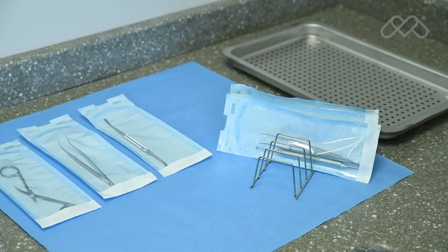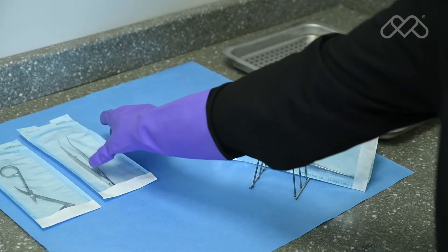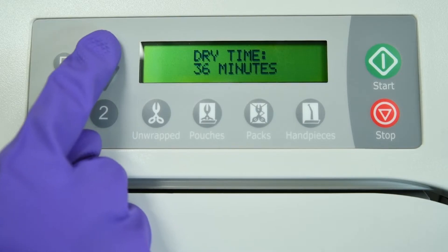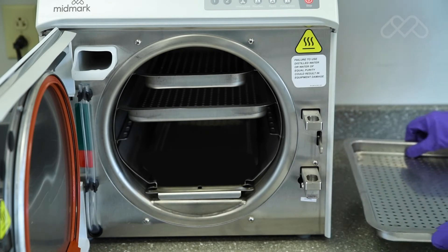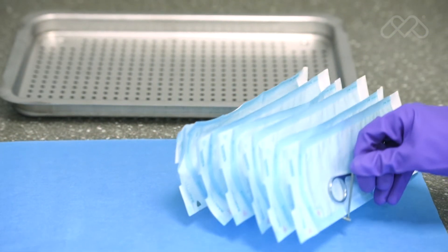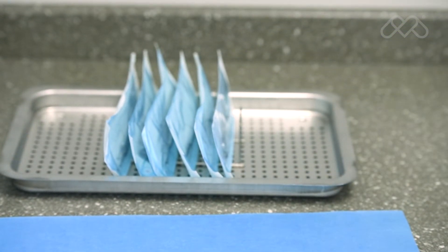For proper steam circulation and drying, the preferred orientation of pouches is resting on their edge. This is best accomplished using the Midmark Pouch Rack supplied with the M9 and M11 sterilizers. If more than two pouch racks are used in a single load, additional dry time may be required. When using the pouch rack, load a single pouch per rack slot, with the plastic side of one pouch facing the paper side of the adjacent pouch.